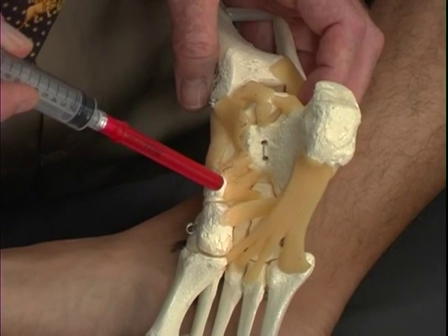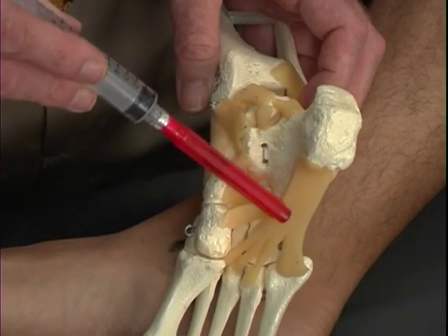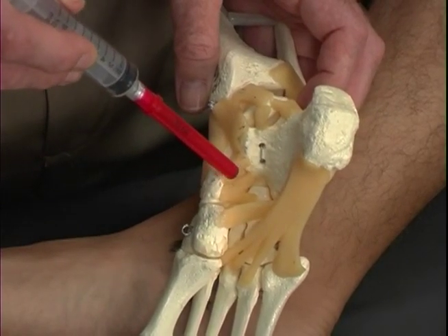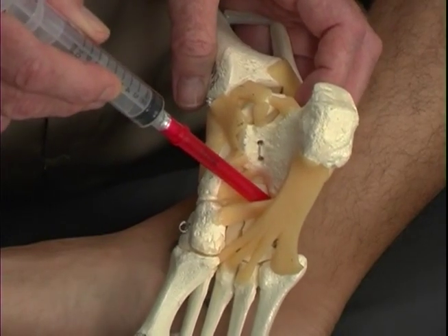We need to be careful as we enter this not to hit the plantar nerve, which can run down here. So we want to keep our needle aimed a little bit upward, walking in across to the cuboid bone, across the underside of the foot.